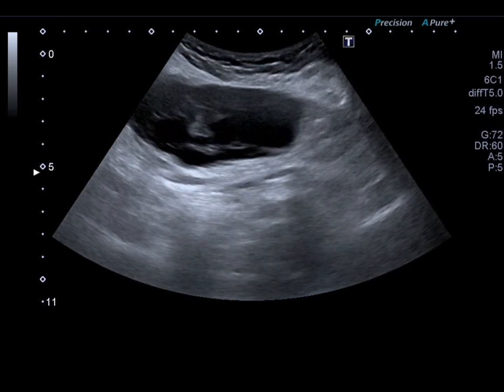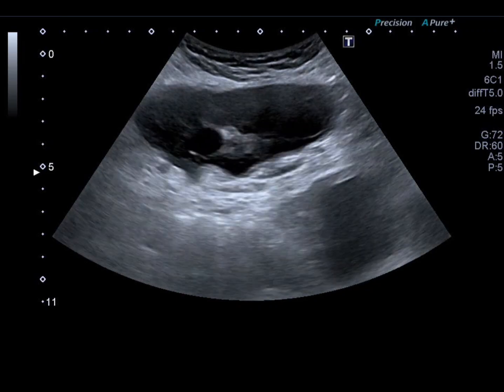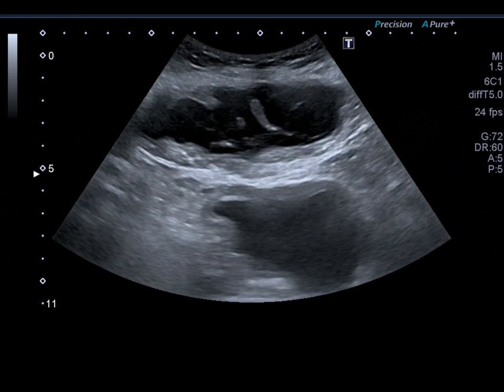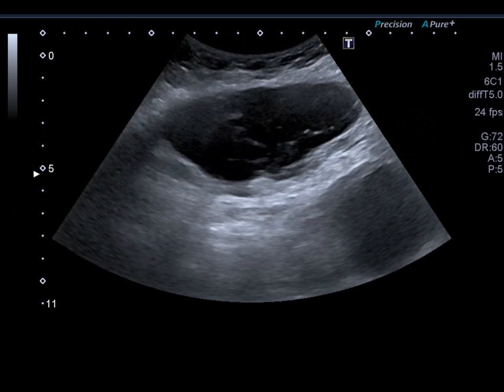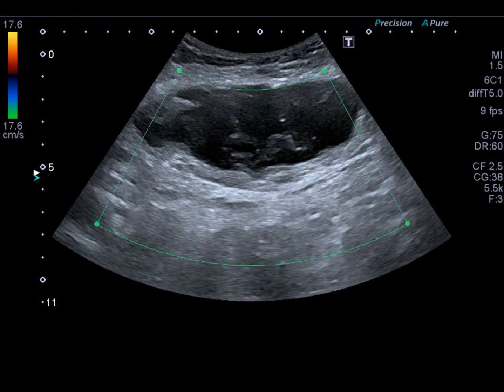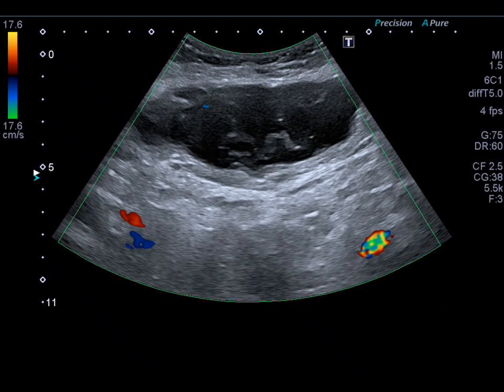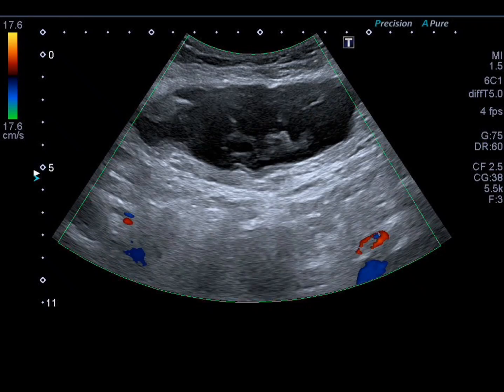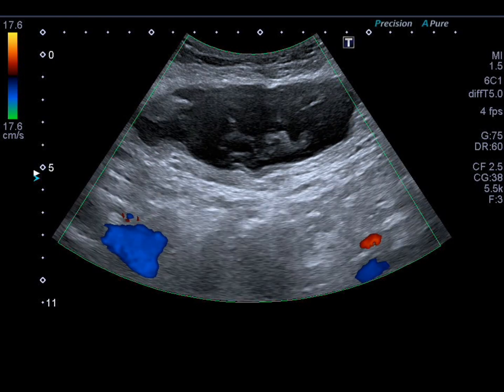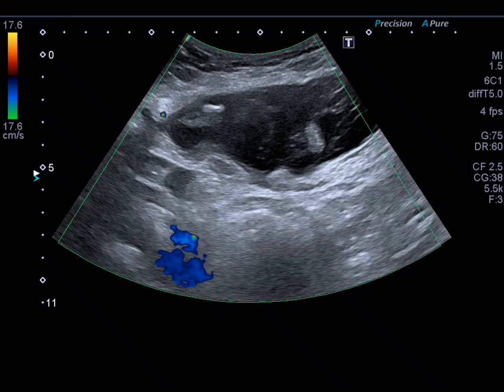While doing the scan for such patients, first ensure you can closely visualize the posterior rectus fascia to confirm the collection hasn't breached the peritoneal cavity, and secondly, evaluate the collection to rule out active arterial pseudoaneurysm or active bleeding. Here, in this case, the collection is completely avascular, confirming a stable, non-active hematoma, as the color Doppler shows no internal vascularity or any kind of active bleeding.